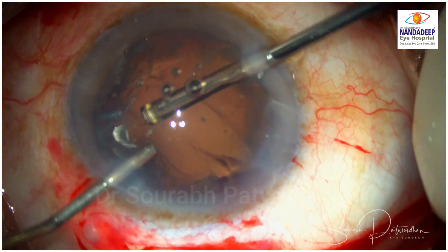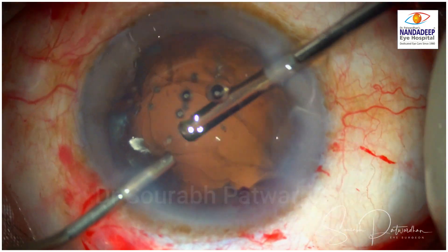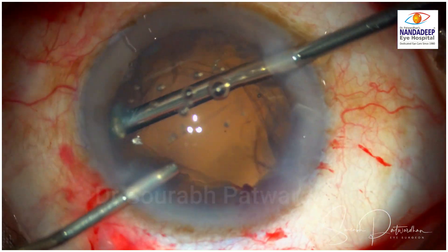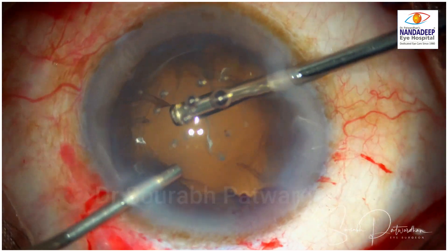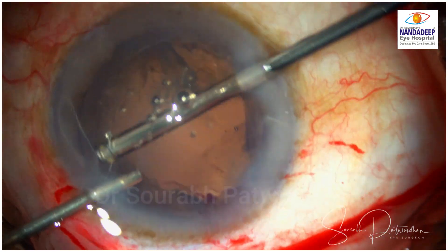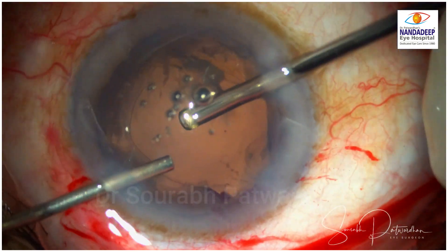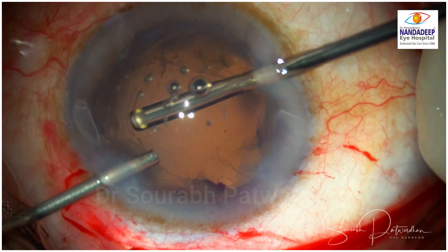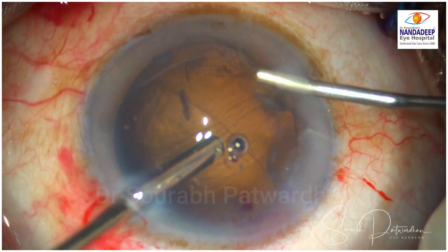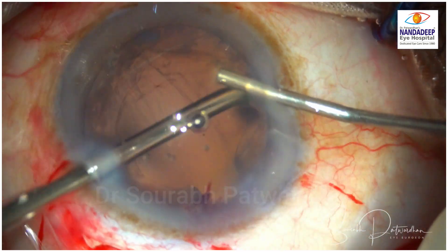Maybe a little bit of vitreous strand there. I am going to use the vitrectomy probe in cut-IA mode first to remove the vitreous from the chamber, and then shift to IA-cut mode where I use aspiration for removal of the residual cortex. There is very little cortex here because most of it was a mature cataract, but it's important to remove it so that we don't get post-operative inflammation. It's important to have good foot switch control. In some machines you get the option of closing the cutting completely while doing aspiration — that is a better option. I am gradually removing all the cortex all around.